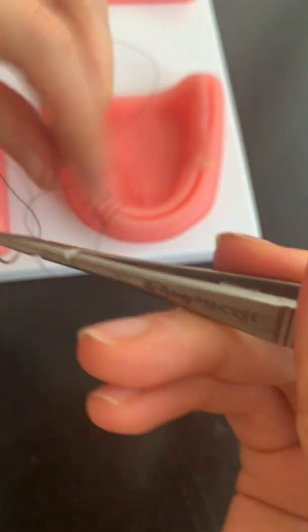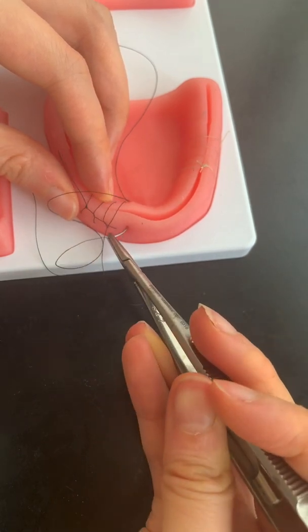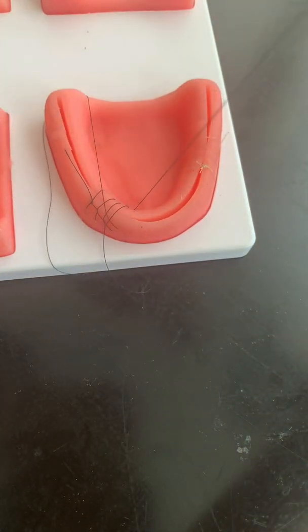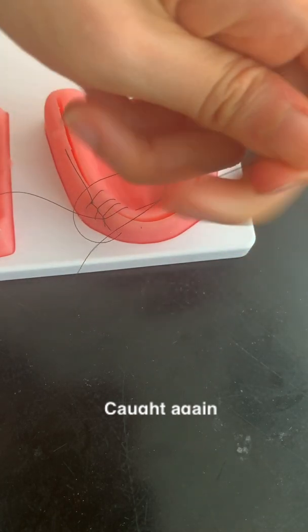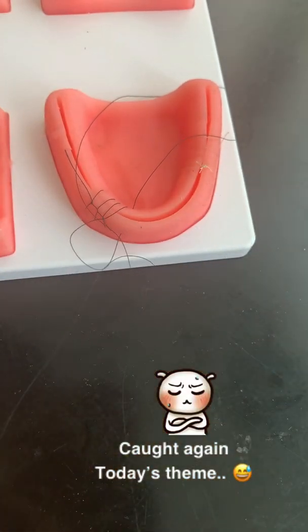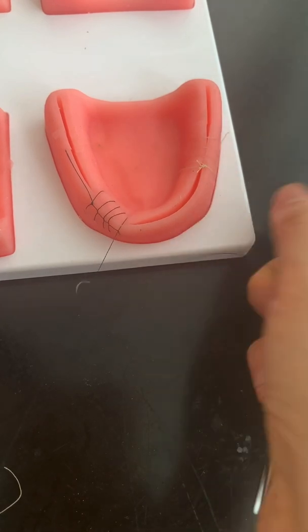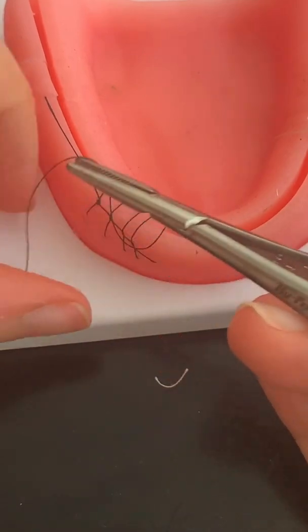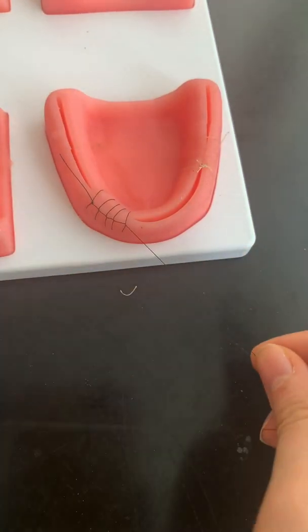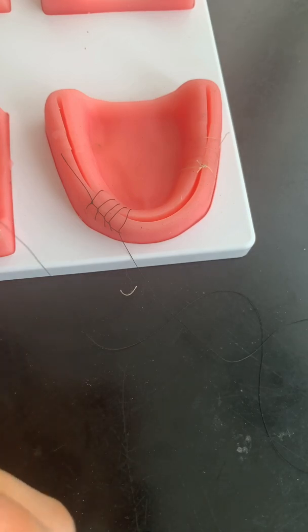Hold this tight — it's starting to look really pretty. So continue, just to make it look pretty, and then I'll show you how to tie it off. About the same width apart and out. It's forming this beautiful looking suture and it's so simple to do. It looks like you really know how to suture, but it's so easy — it's just simple interrupted and then you put it through the loop.